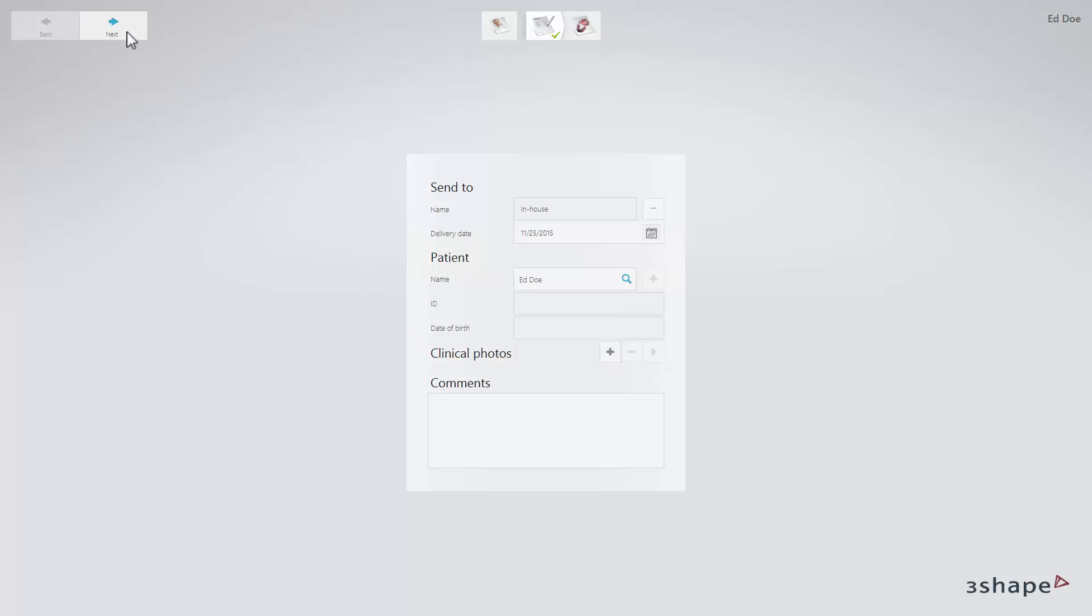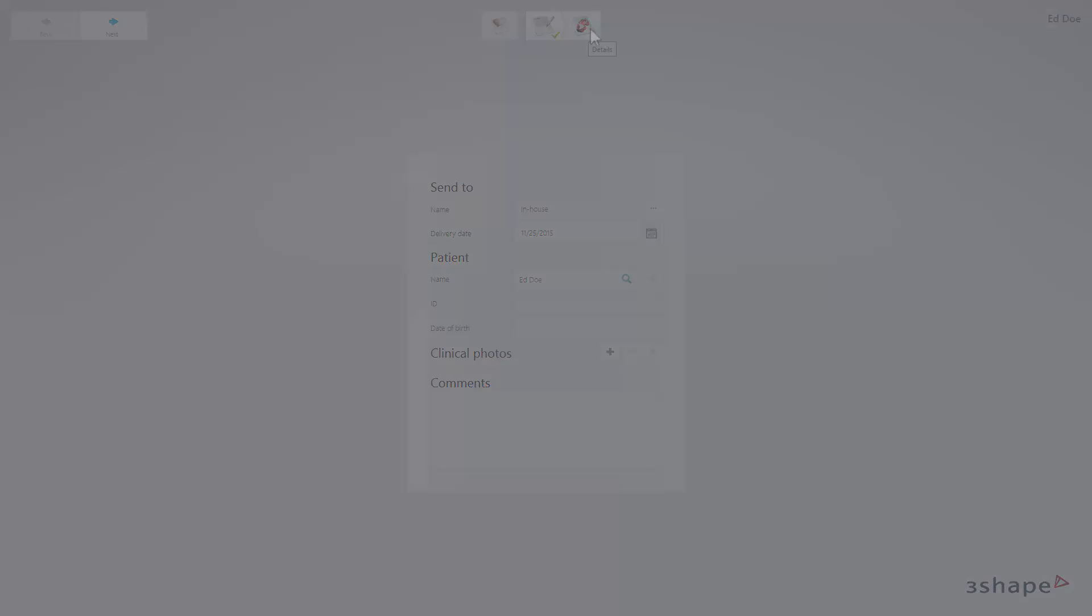Click Next or the Details icon in the workflow bar to move to the Details page.